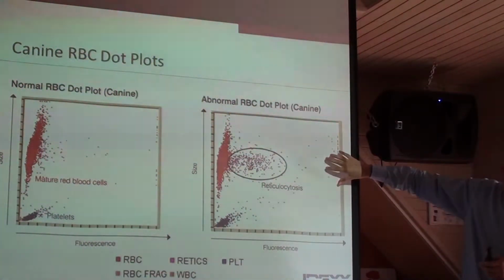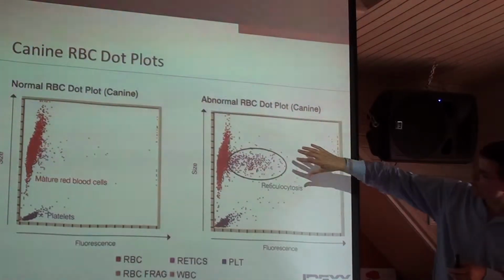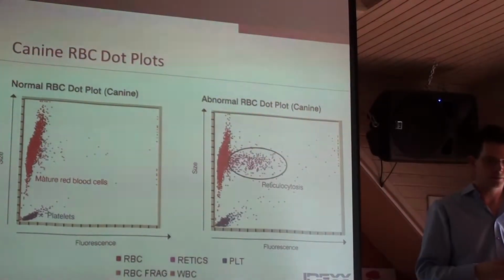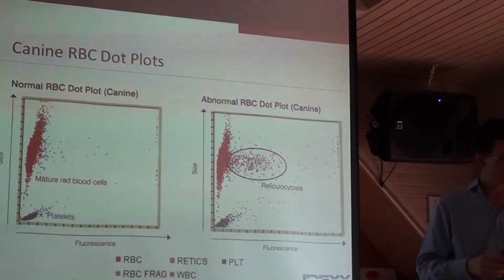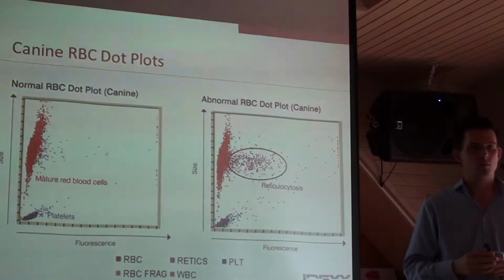So younger cells are found in this area, more mature cells are found over here.